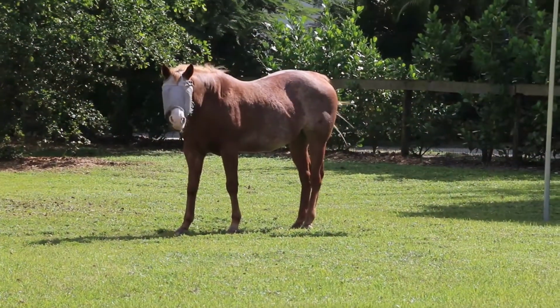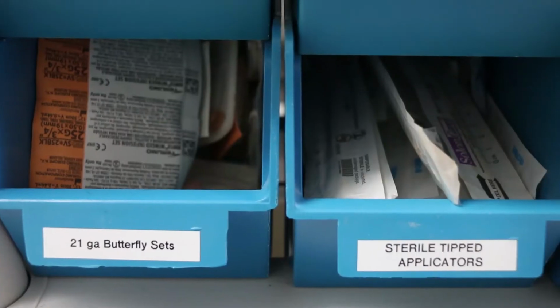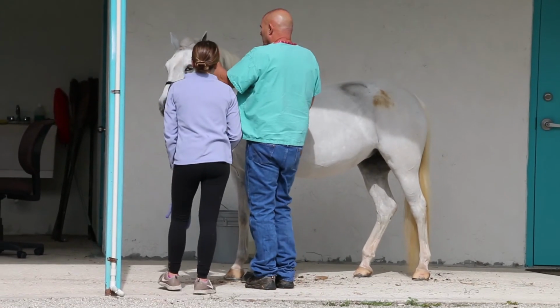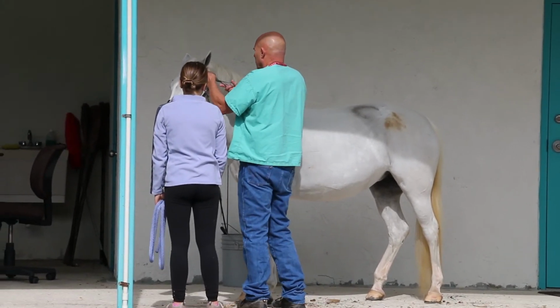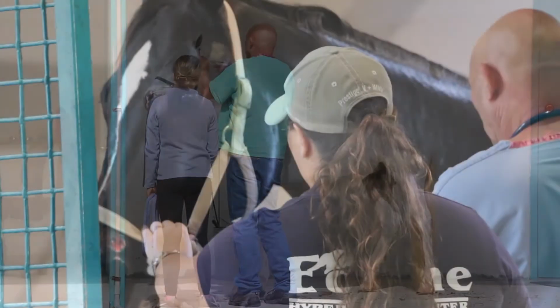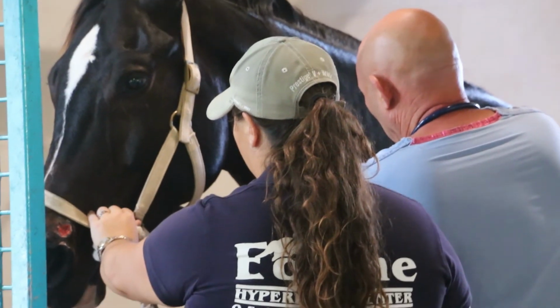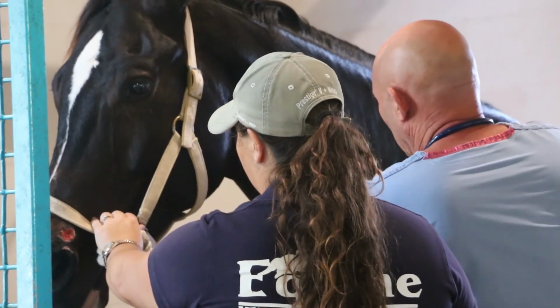The horses, we assess their demeanor. But the first time in the chamber, we tranquilize them just about anyway, because even though they might be perfectly happy, we don't know how they're going to react when the door's closed and the noise starts. So we always tranquilize them for their first experience, and we often tranquilize them for subsequent experiences too.